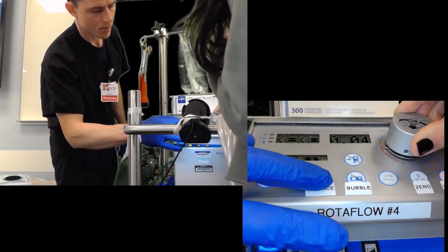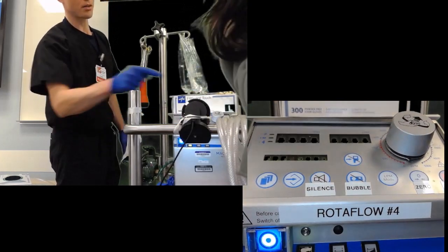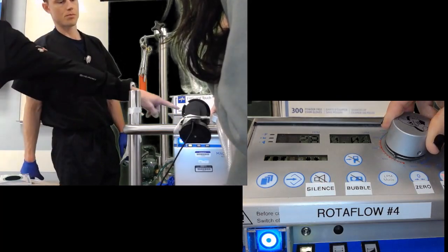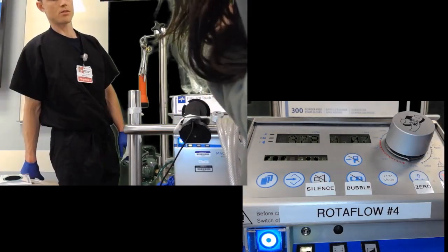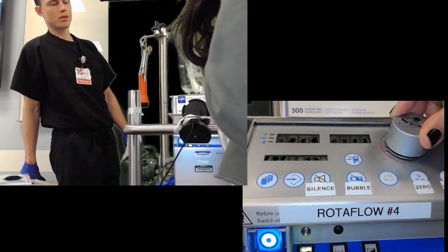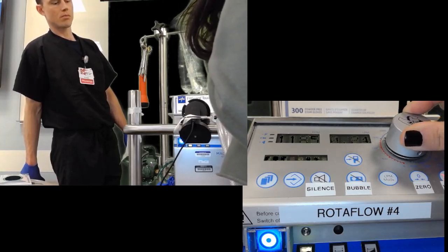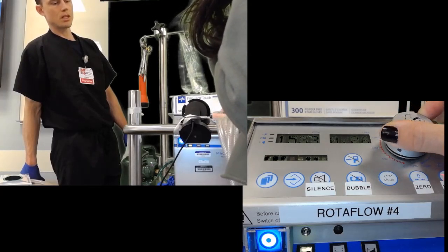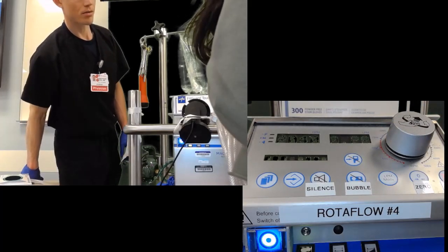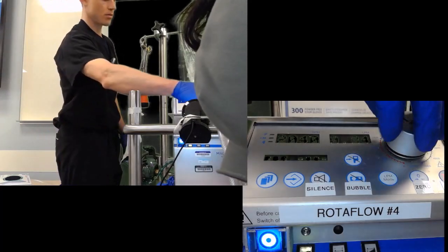Now I have flow, but I don't have RPMs. There you go. So now you're back at 0. So it has to say 0 on the RPM, not 0 on the flow, I guess? Yeah, it's 0 on there. Okay, you're good. You start turning it up. You'll see the RPMs go up, and now we should start seeing our flow going up. And it's beeping because the flow is still low. Now we've reached a flow. What do you have there? Flow of 0.3. Okay, it's still pretty low. Go up a little more.